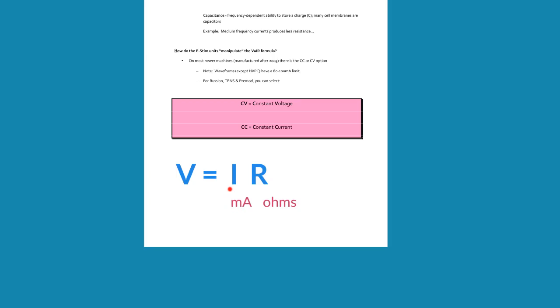The exception to that is if you're dealing with microcurrent, which we're not necessarily going over. Microcurrent will be measured in microamperage, and 1,000 microamps would be equivalent to 1 milliamp. But you can imagine if something is turned up to less than 1 milliamp, it's typically subsensory and the patient doesn't feel that. But that is something used in wound healing. And that's just an FYI. That's in your guide under microcurrent.